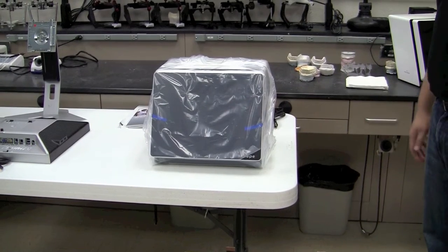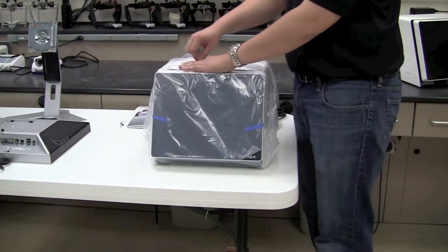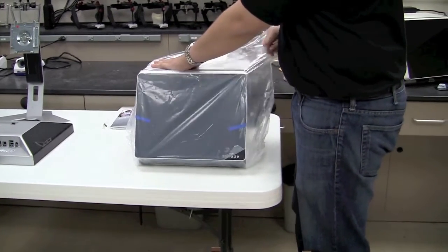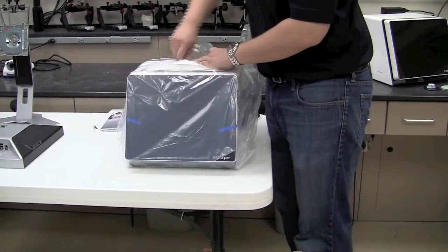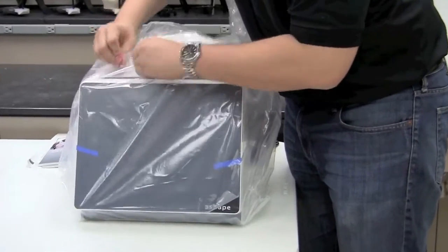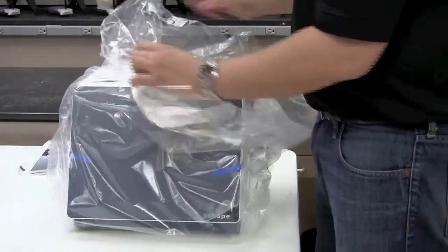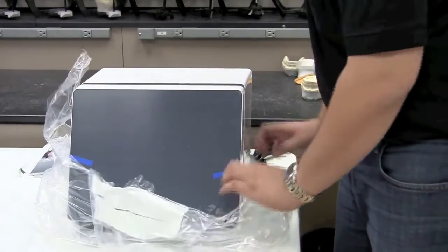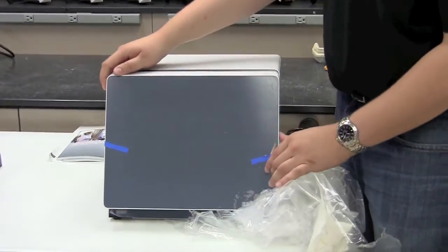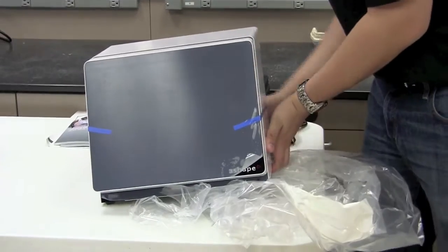At this point, go ahead and remove the plastic from the scanner. Fold it down around the outside of the scanner, and if you need to, you can tilt it to one side. Make sure that you do not pull it along the door or pick it up along the door. You can just lift it up and remove the plastic from the bottom.